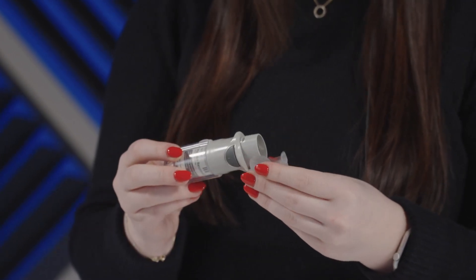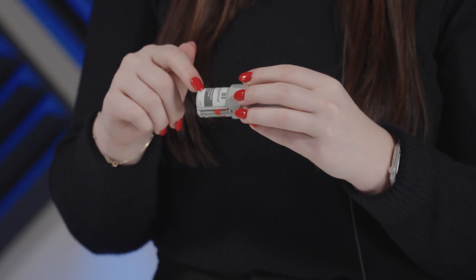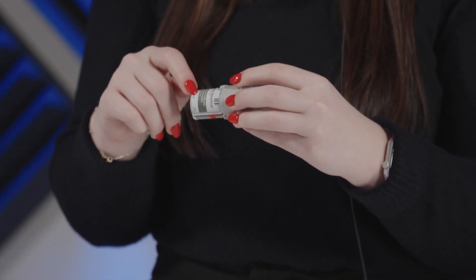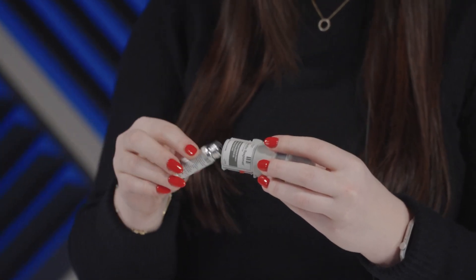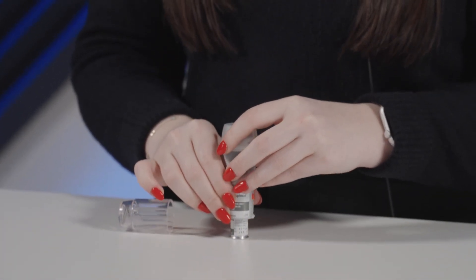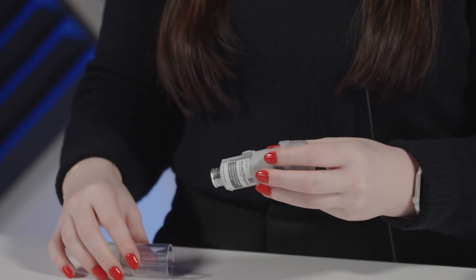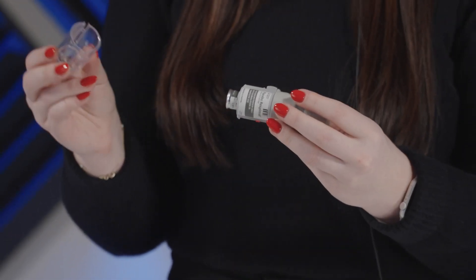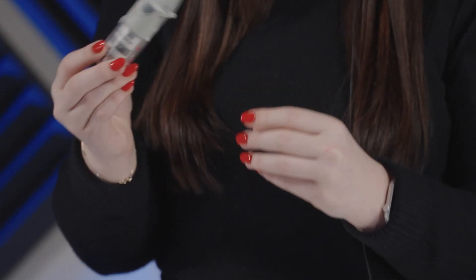For administering the inhaler, before you do so, you'll want to set it up. With the cap closed, you're going to pull off the clear base, and then you'll write the discard date on the label, which is three months from when the cartridge is inserted. Next, you'll insert the narrow end of the cartridge into the inhaler. On a firm surface, you're going to push the inhaler down until the cartridge clicks into place. After that, you'll put the clear base back into place until you hear it click, and your inhaler is now set up.